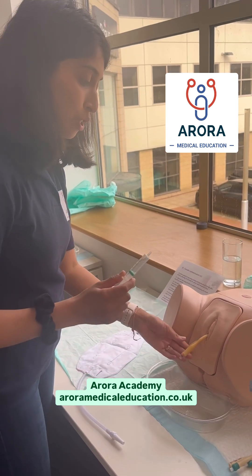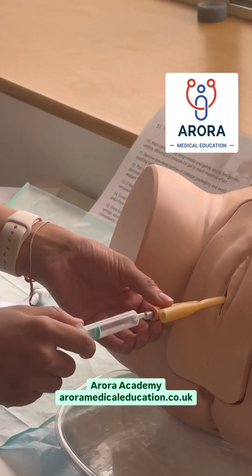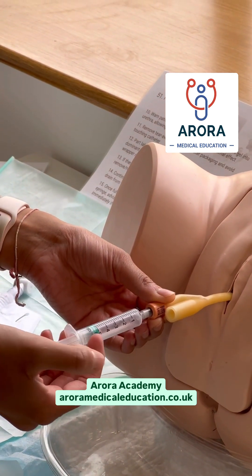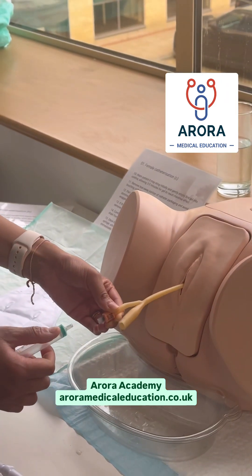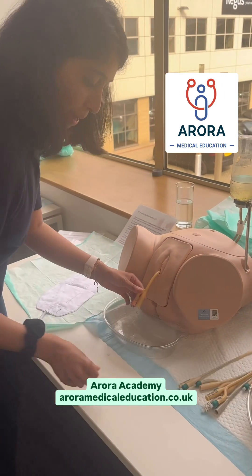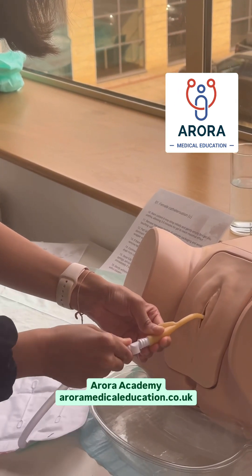So which one's which? The smallest hole is usually for the syringe and it's the only hole the syringe will really fit into comfortably. That's when you blow up your balloon to make sure it's in place in the catheter, and you can pull back to ensure it's in place. The bigger hole is for your catheter bag, and that just fits in really nice and snug.